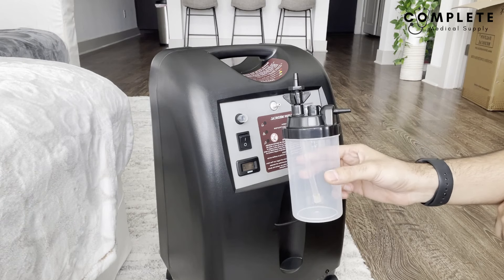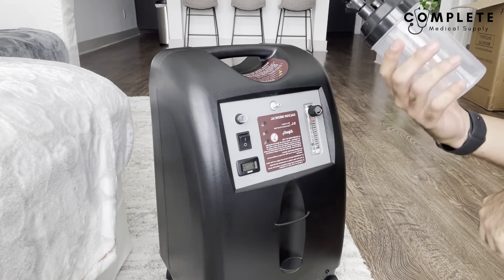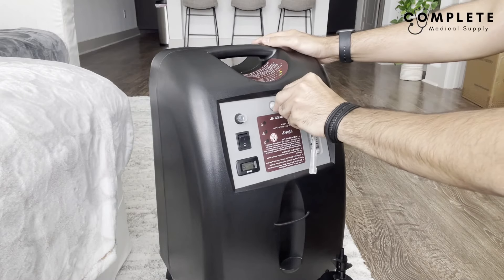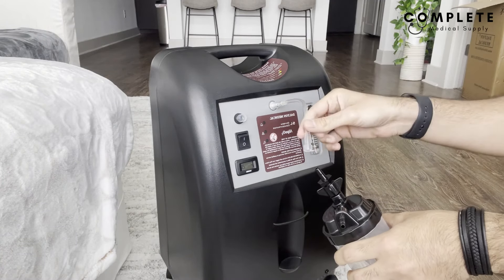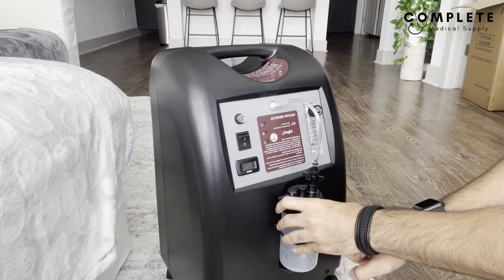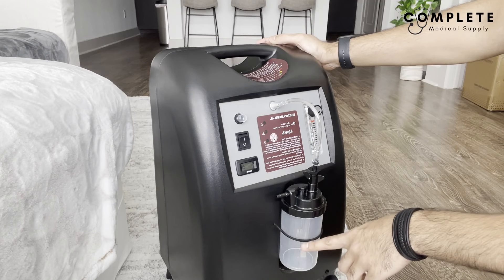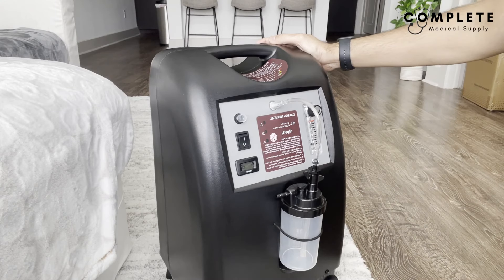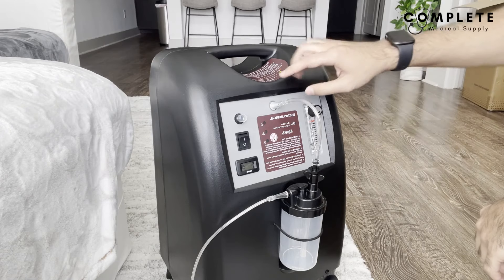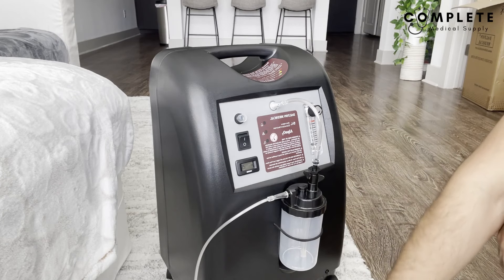Another option is using a humidifier bottle, which makes the oxygen a little less dry coming in. It's optional — not everybody may need it — but it sometimes comes with the unit. The tubing connector goes in here first, and the other end connects to the top of the humidifier. Fill it with distilled water up to about the halfway line — not all the way to the top — and once filled, connect the tubing from the output into the bottle, causing the water to bubble and add moisture before the oxygen enters the nose.